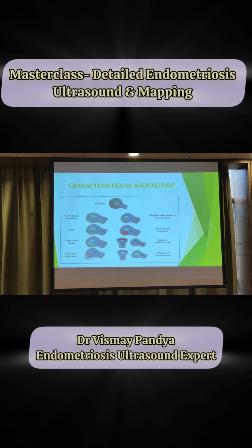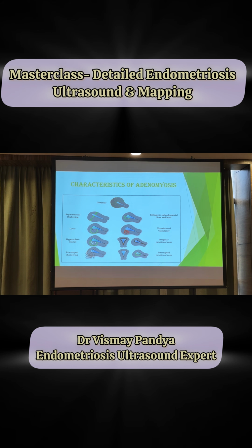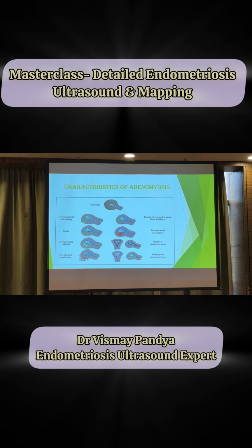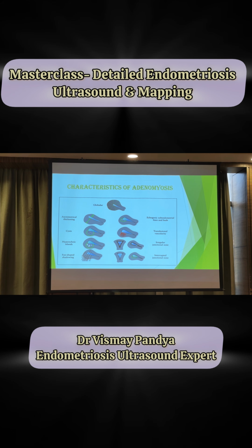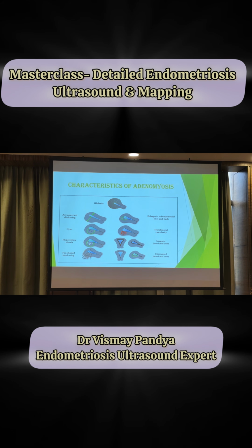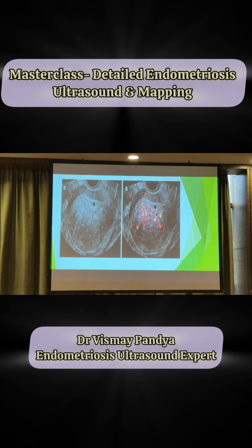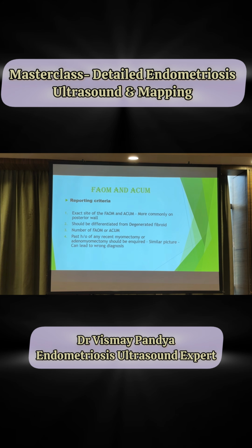We all know the characteristics of adenomyosis: asymmetrical thickening with cysts and fan-shaped shadowing. These are all the general features, and translesional vascularity, which differentiates it from a fibroid. You can see this adenomyosis, how it looks, a generalized picture.